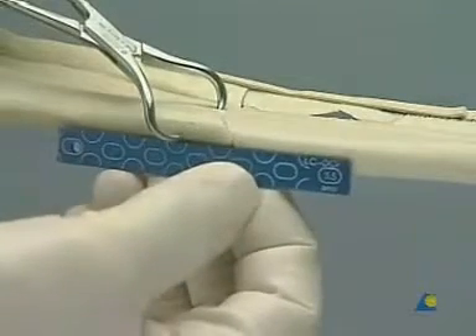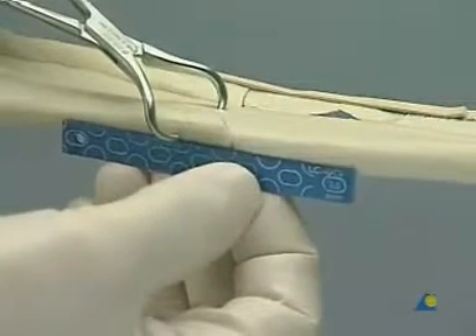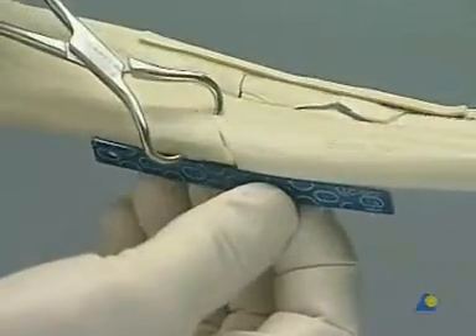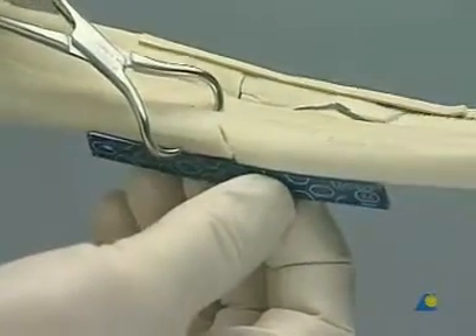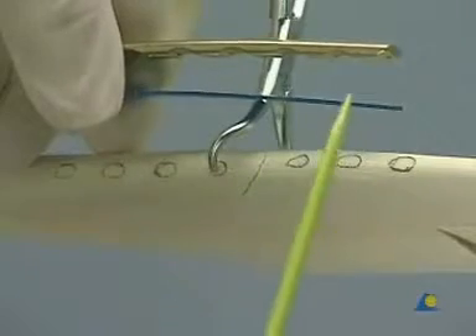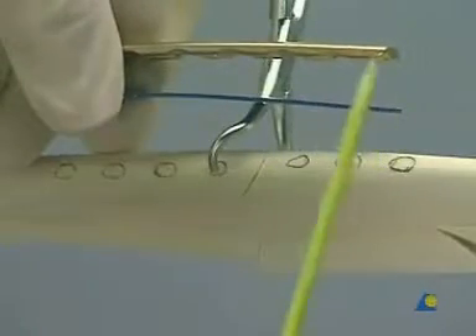Use a template to contour the plate to the lateral surface of the radius, so as to leave three holes proximal and four holes distal to the fracture line. The need to place the lag screw at a right angle to the fracture line will determine the final position of the plate.